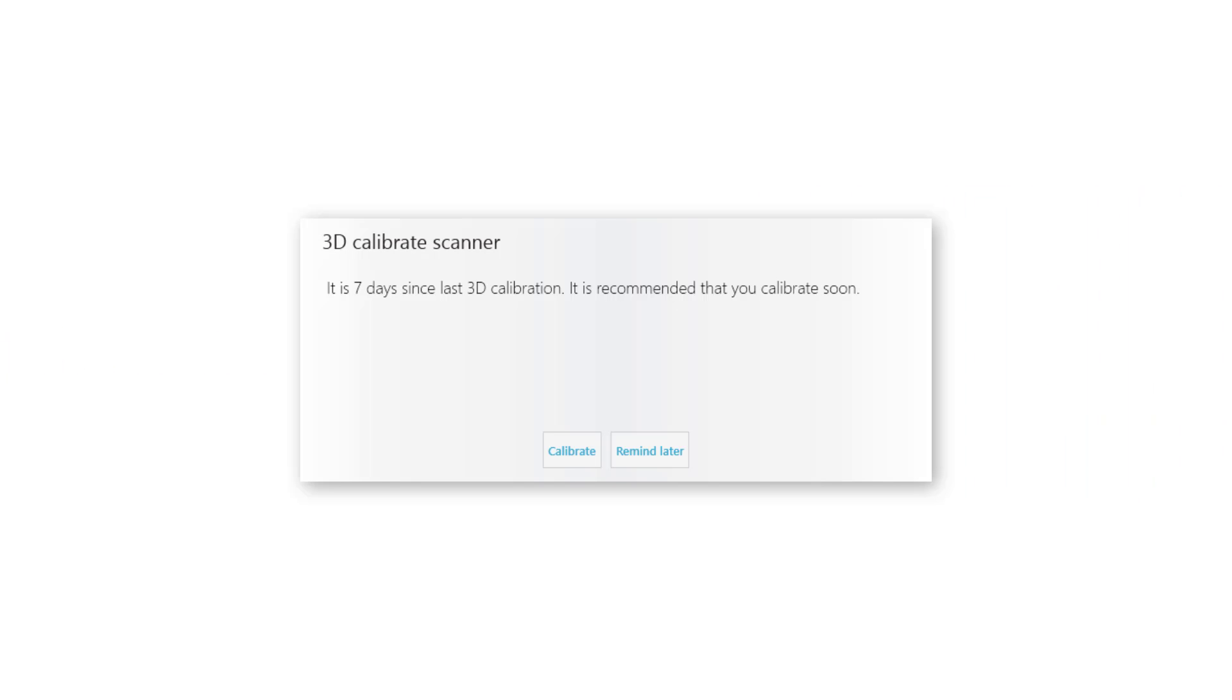If calibration is not done for 7 days, the TRIOS application will automatically remind you about it. A message for a missing calibration type will appear on the screen upon opening a new order, as I will show right now.